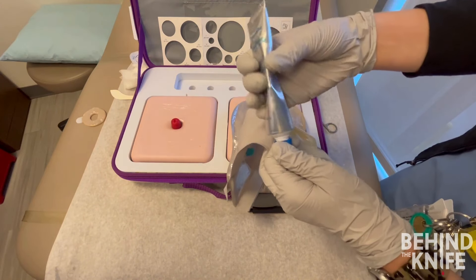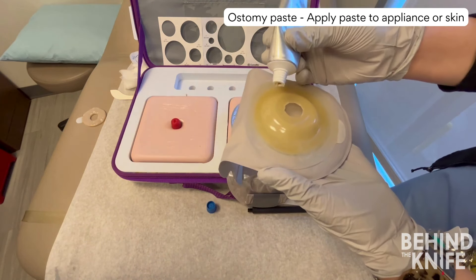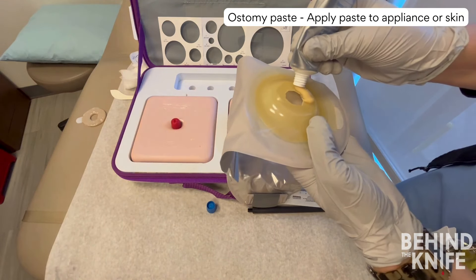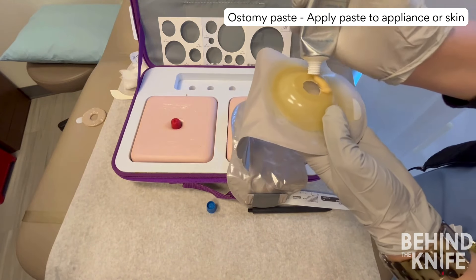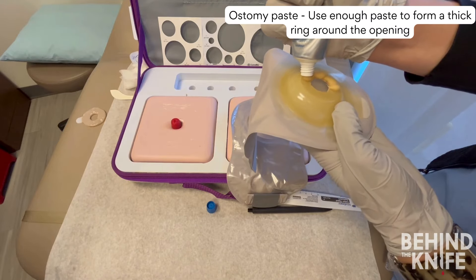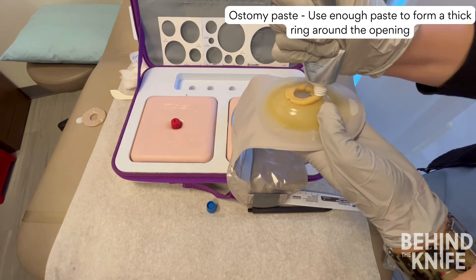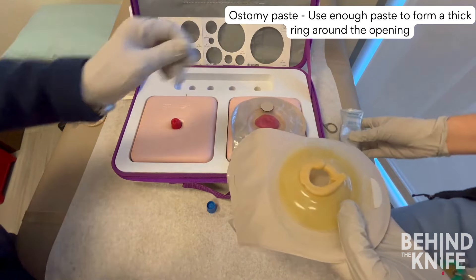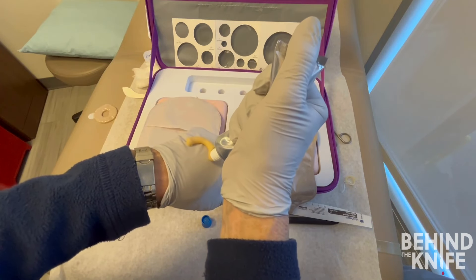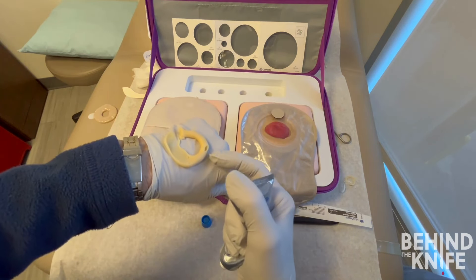The other accessory is ostomy paste. You can apply the paste to the appliance or the patient's skin. When applying the paste, use enough to form a thick ring around the opening. When you apply the appliance, the ring of paste will disperse and fill in any gaps between the stoma and the appliance to protect the skin. If you apply too much pressure and too little paste, the ring will flatten out and will not be able to disperse appropriately.